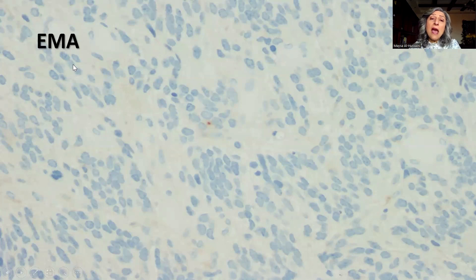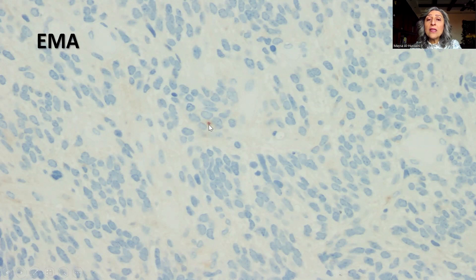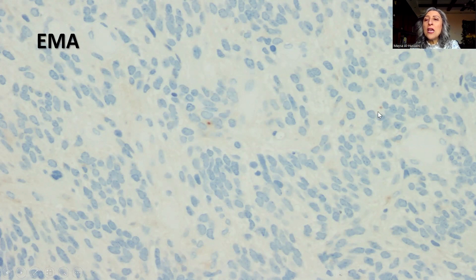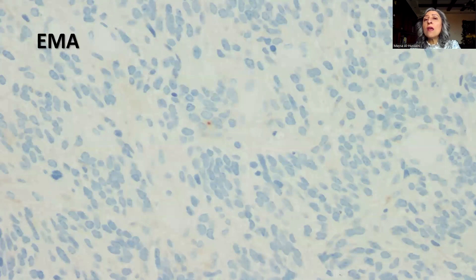With EMA, as we would expect in ependymoma, we look for the presence of intracytoplasmic dot-like positivity to support the diagnosis. What is usually expected is to find at least five tumor cells showing this dot-like cytoplasmic positivity. Scattered positive cells would be unacceptable for a confident diagnosis of ependymoma.